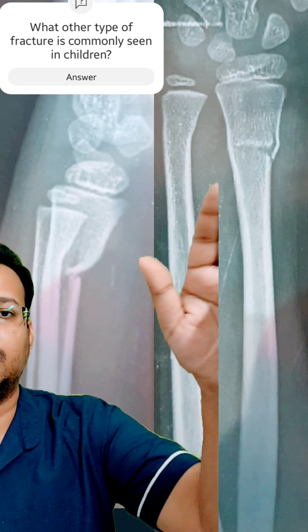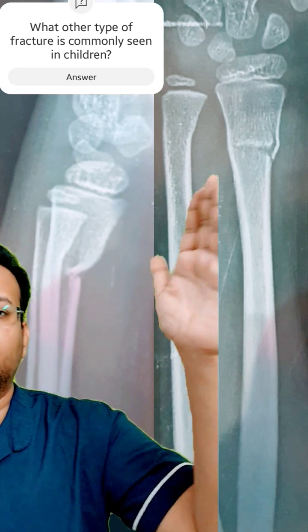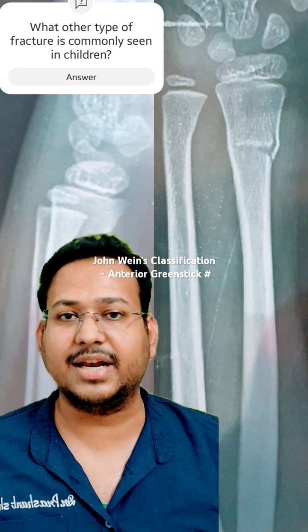Similarly, in the AP view also, you can see the buckling and fracture line, and the breaking of cortex on one side, while the other cortex is intact. So yes, this is a greenstick fracture.